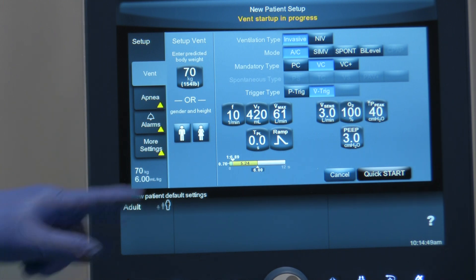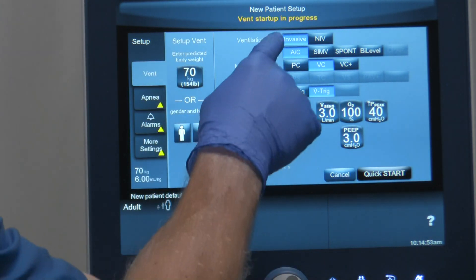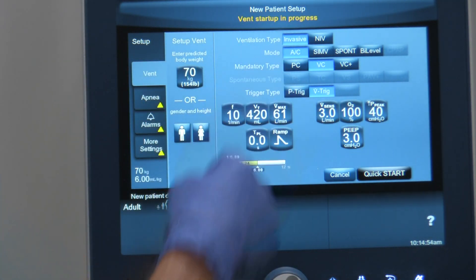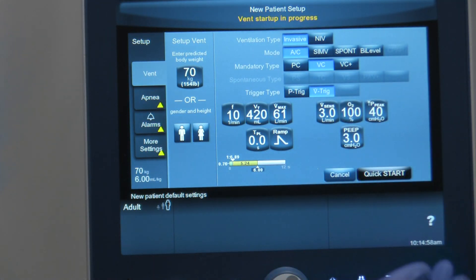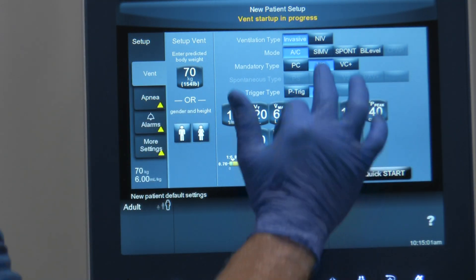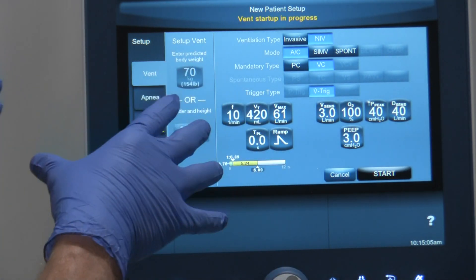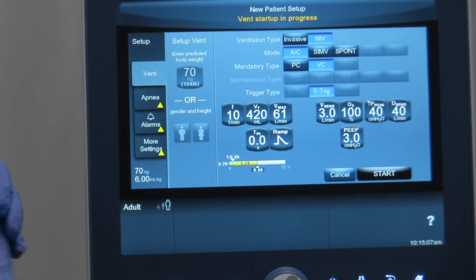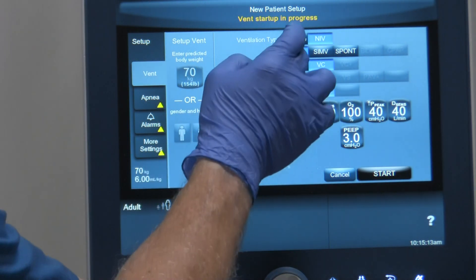So looking at the top — when it comes to ventilation type, it allows us to choose from invasive, which is the default, to non-invasive. To choose non-invasive, if you're going to do non-invasive ventilation, simply toggle. When you go to non-invasive, it brings up the values that are set for that particular type of ventilation. So we'll go back to invasive.